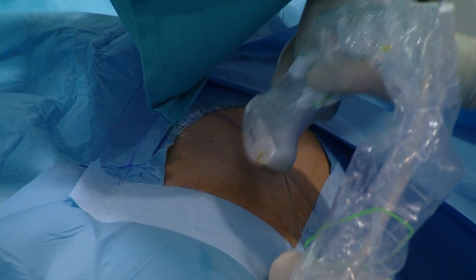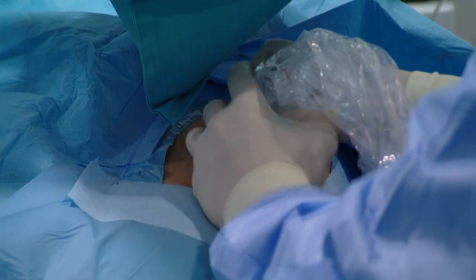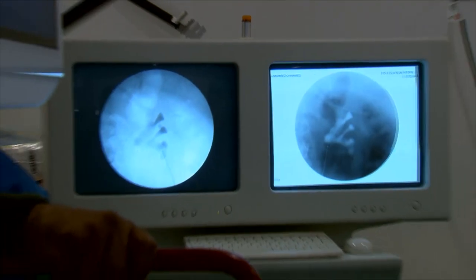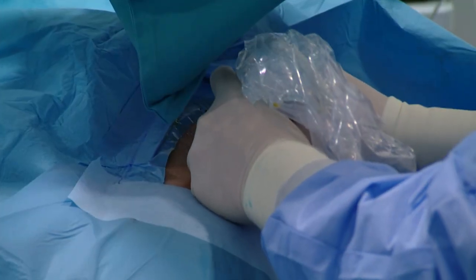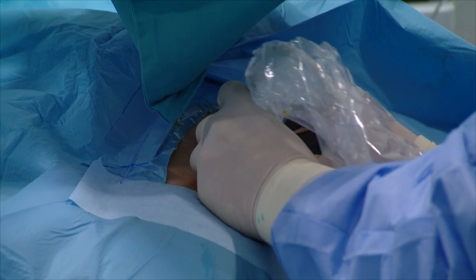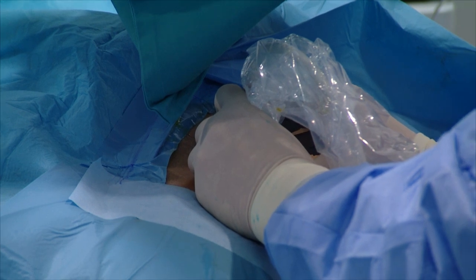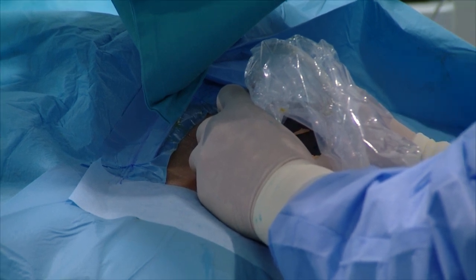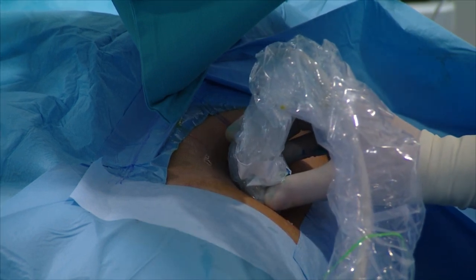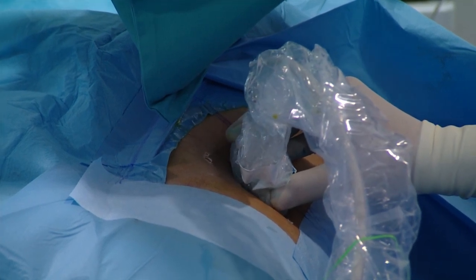Now I take ultrasound here. Now let's have a look at the ultrasound. Please show us the ultrasound image. Leave the view like this. Thank you very much. Now you can see the lower pole kidney clearly, and I know that is our target area. Once more, back to our ultrasound probe. We see both views. Now let's have a look at the ultrasound probe.